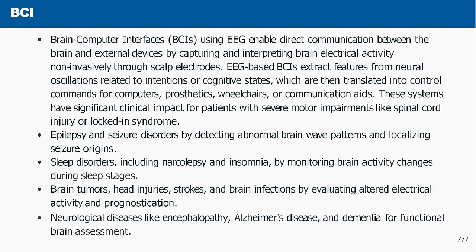Now finally, what we can capture through this electroencephalogram has significant importance in brain computer interfacing. Brain computer interfacing, or BCI, using EEG enables direct communication between the brain and an external device by capturing and interpreting brain electrical activity in a non-invasive manner.